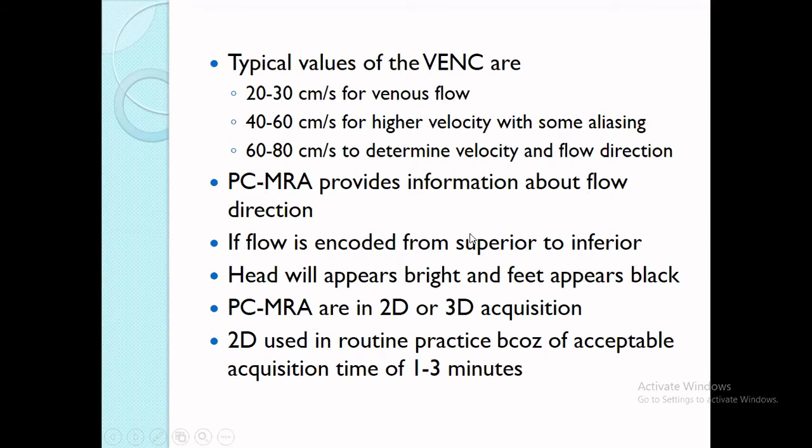Because in this phase contrast imaging, we are not only imaging the arteries, but we are also imaging the veins, but it depends on the direction in which we are selecting this particular study. So the head will appear bright and the feet will appear black. This is an example of whole body imaging. The head will appear as a bright one and the feet will appear as a black one.